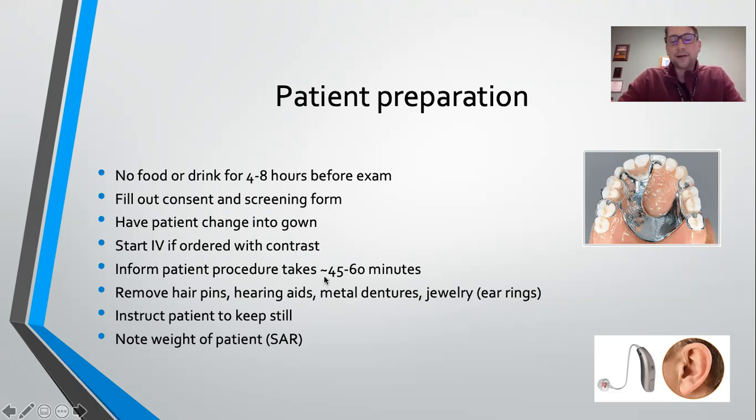Typically these take about 30 minutes, but sometimes depending on if it's an EOVIST study or if they're looking at a certain area of the abdomen, or if it's an abdomen and pelvis combined, these studies can really start to kind of increase in your time, 45 minutes to 60 minutes.